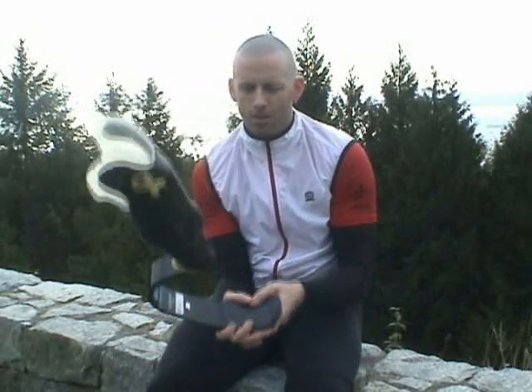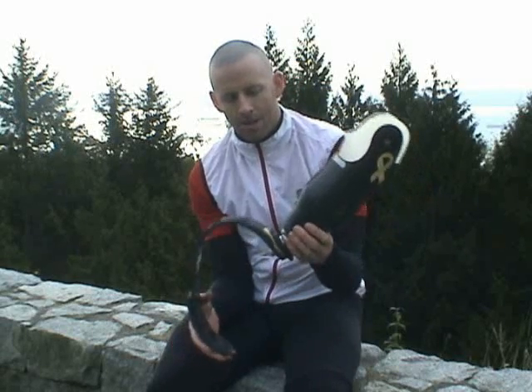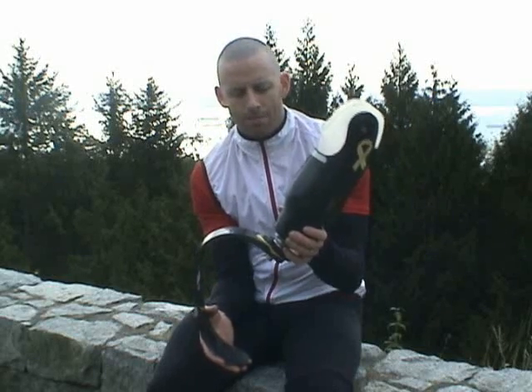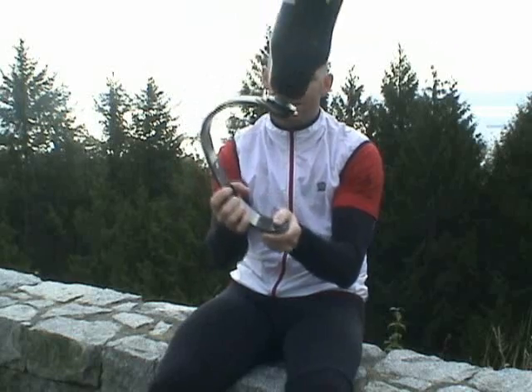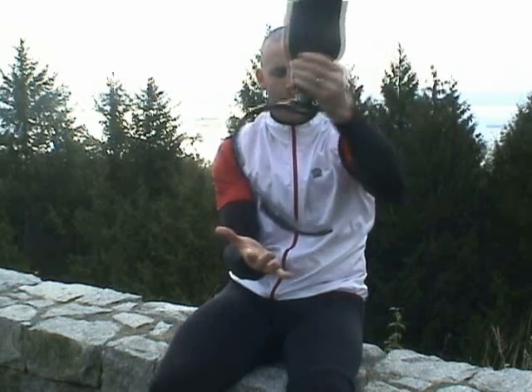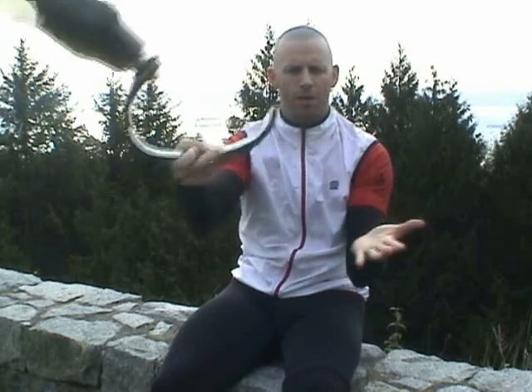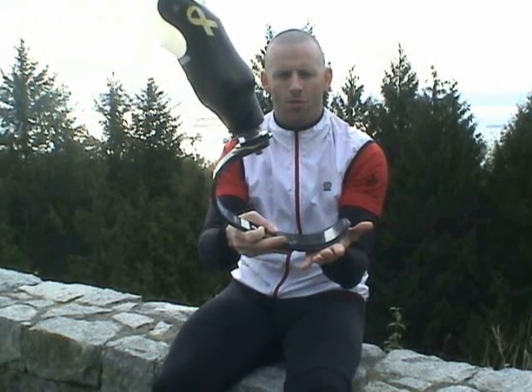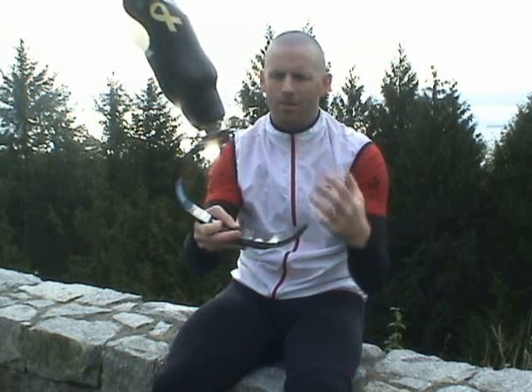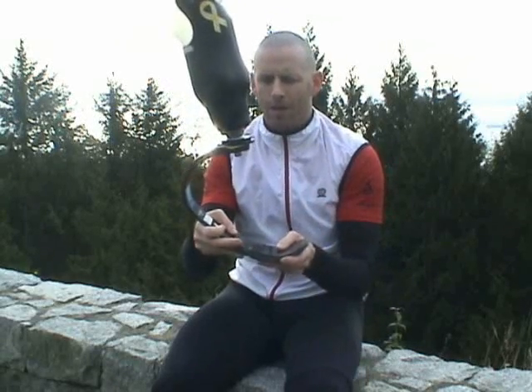One of the tricks when you're learning to use a running leg, which takes some time, it took me maybe 4 to 6 months to feel like I was really getting the most out of it, is that as the leg touches down, you need to have it in a forward position so that it springs this way. A lot of people run with their legs in front of them, and if you land like that, it'll spring you backwards. A lot of amputees actually still do run that way, at a great expense to their economy and their energy, and their leg and their skin, and it causes all types of bad reactions.